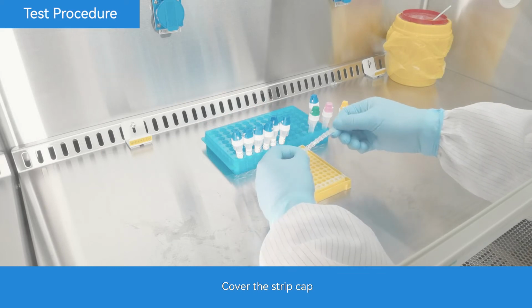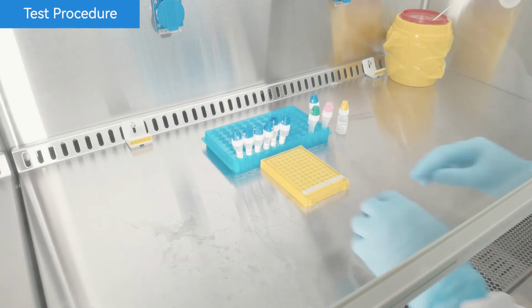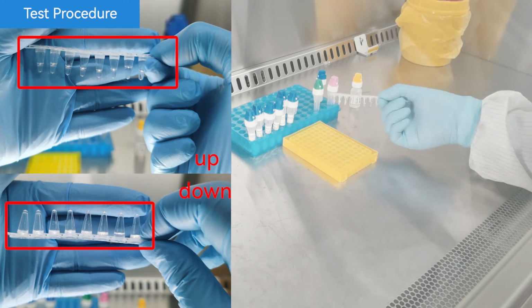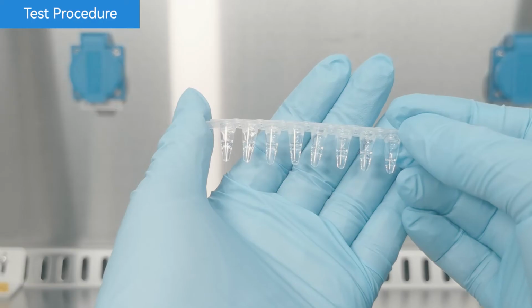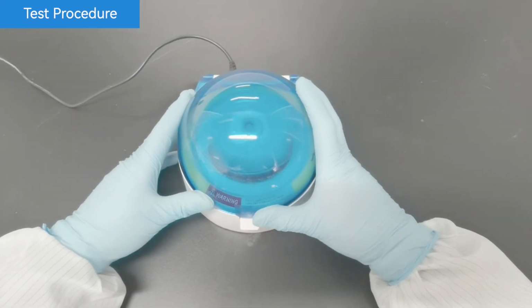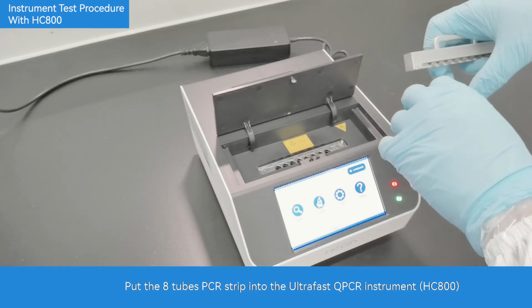Cover the strip cap. Centrifuge for 10 seconds. Put the 8 tubes PCR strip into the ultrafast qPCR instrument.